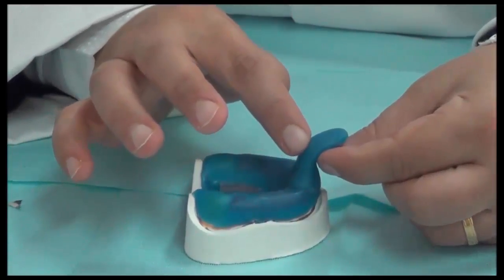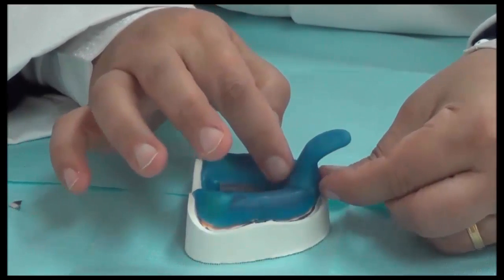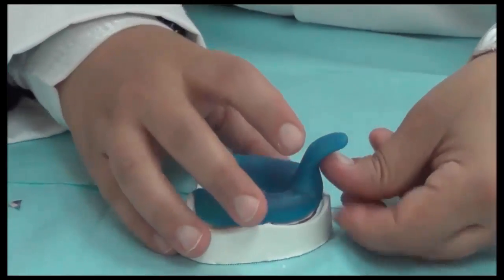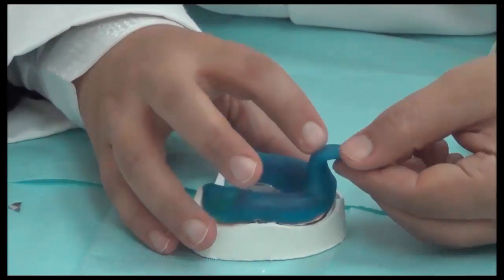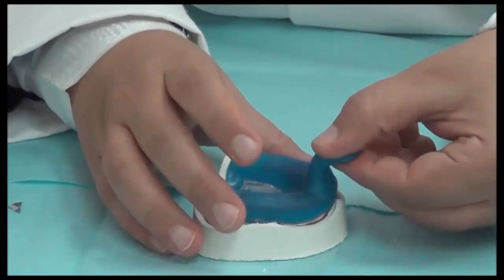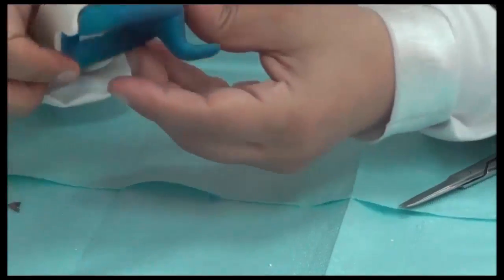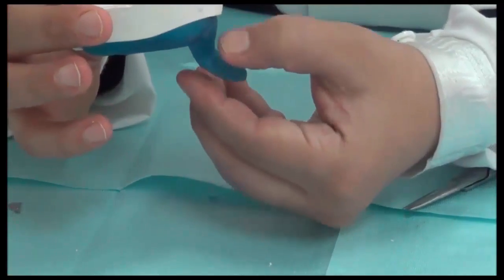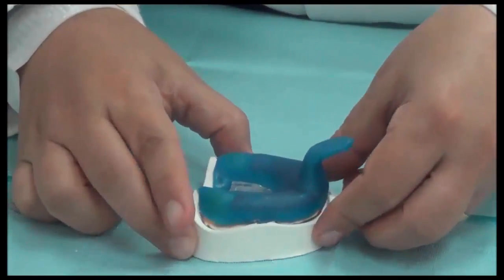The body goes up vertically or a bit labially, it's okay, but vertically is safer. And then on the last bit of it, it bends to the outside and it becomes flat. This provides a grip for the dentist when he's holding the tray in and out of the patient's mouth. So if this is the patient's upper mouth, the dentist has a grip to hold the tray and put it back. And now this is ready to be light cured.